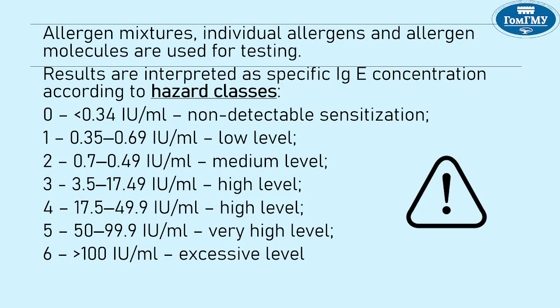Allergen mixtures, individual allergens, and allergen molecules are used for testing. Results are interpreted as specific IgE concentration according to hazard classes: 0, non-detectable sensitization, low level, medium level, high level, very high level, and excessive level.